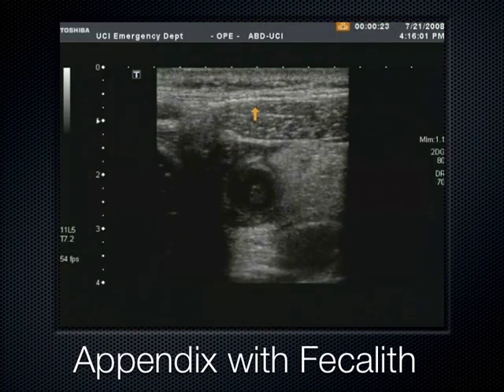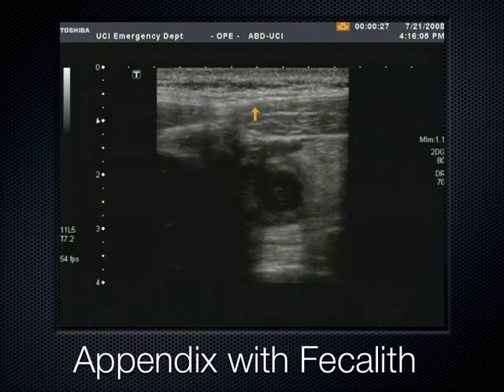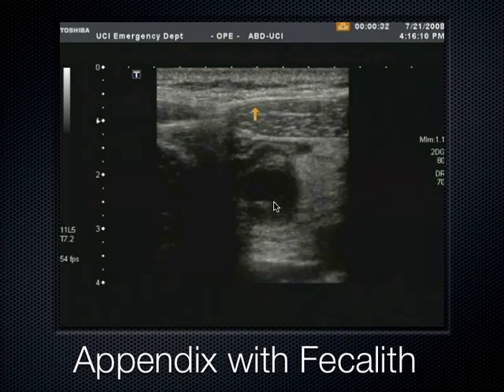This comes up all the time with the gallbladder. People go, oh, what's that thing over there? What's that mass in there? And it's just the duodenum seen on end sometimes, can look a lot like this. It looks like any other part of the intestines. We'll get to that in a minute.